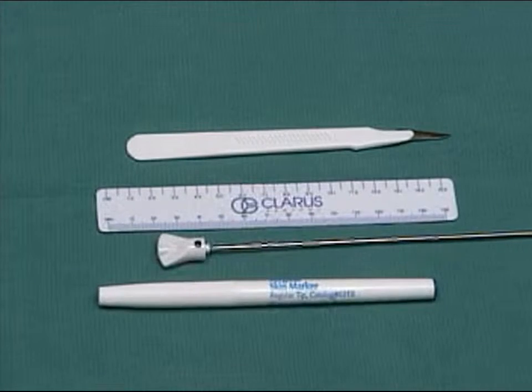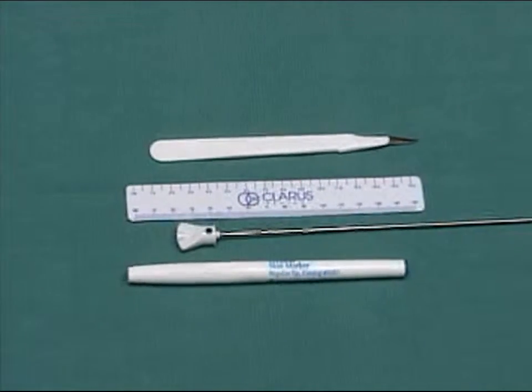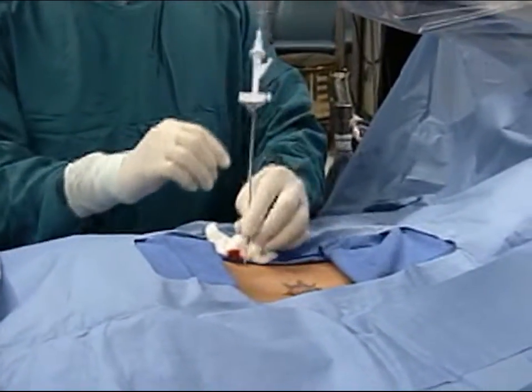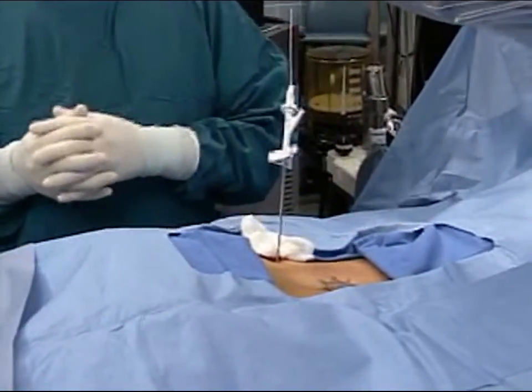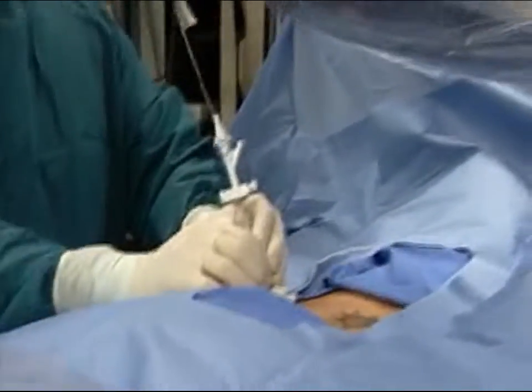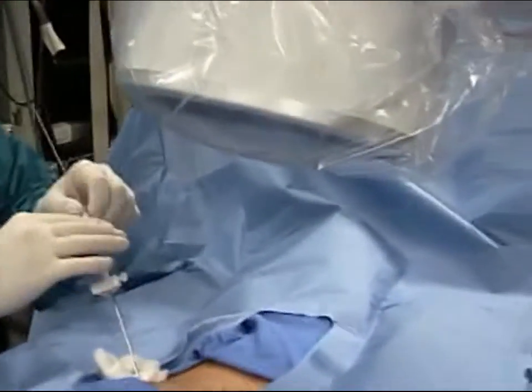Use the scalpel to make a simple stab wound by the guide needle so the working channel and the dilator can pass through the skin and fascia easily. Lock the working channel and the dilator together and pass them over the guide needle. Advance them to the annulus. Check with AP and lateral fluoroscopy. Your goal is to place the distal end of the working channel into the nucleus.